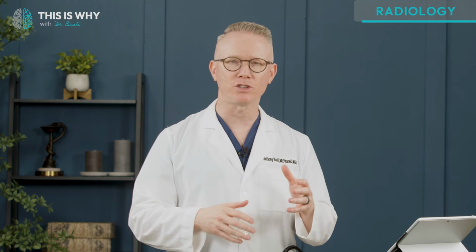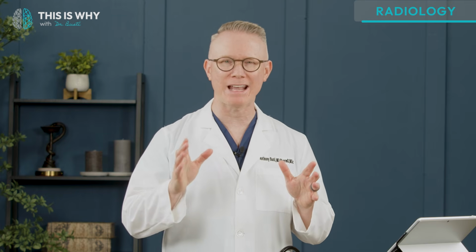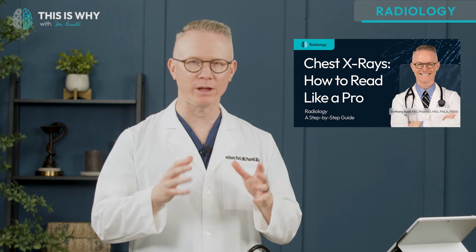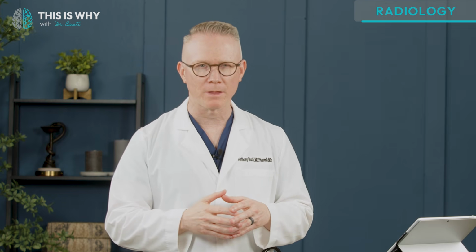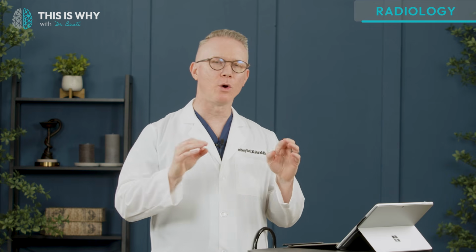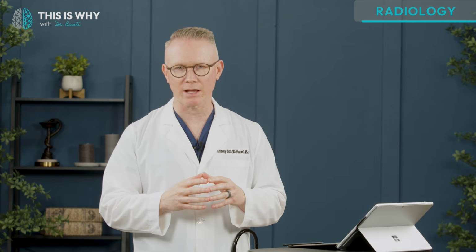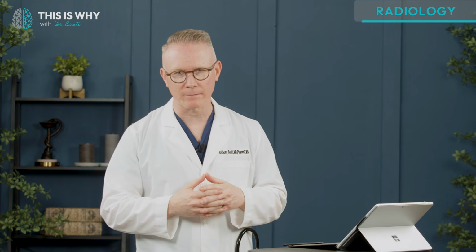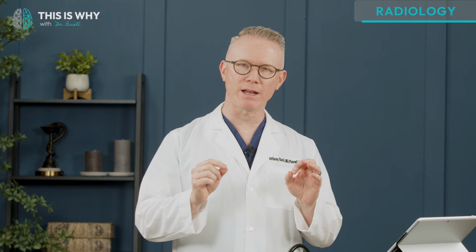Now, the RIPE mnemonic should be considered every time you open a new chest X-ray. And if you want a full review on how to use RIPE and the A through I mnemonic when reading a chest X-ray, check out my video on how to read a chest X-ray like a pro. Why does this stuff matter? Because there is literally no point in interpreting a chest X-ray that's either done wrong or that is of poor diagnostic quality.